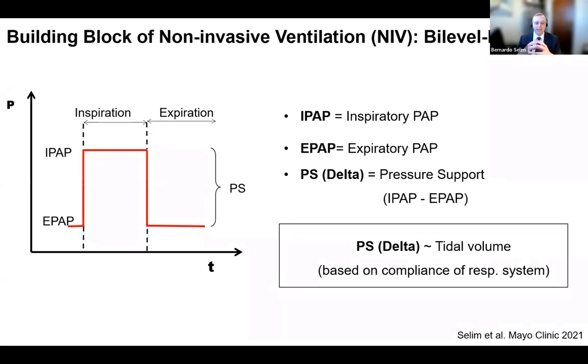And if you understand with a strong concept what a bi-level means and what the components are, you will understand any mode that is BiPAP based, which by the way, are all the NIVs. It doesn't matter how much they want to spin the names commercially, you will understand the building blocks or the basic structures of it. You can deconstruct the mode.